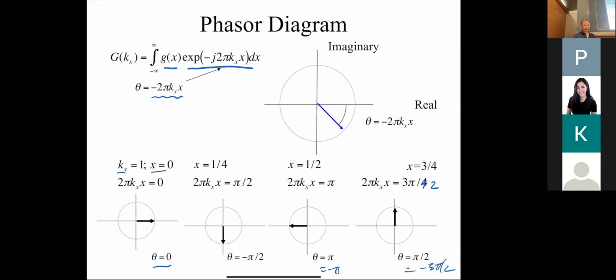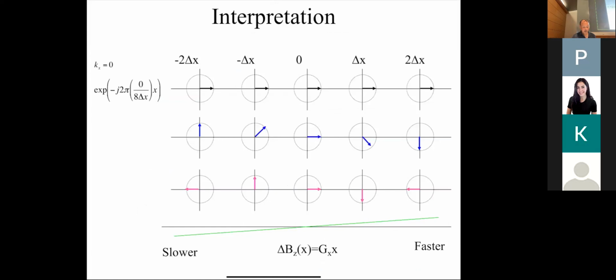So basically, all it's saying is this thing that we need in our Fourier transform is a spatially varying phase, right? And we saw that in MR, we can get that spatially varying phase just by having spins precess at different frequencies, okay? So we'll look at things as a function of time. Remember, our experiment was we're looking at how the spins evolve over time. So at time equals 0, we assume all the spins are in phase, so that means that kx equals 0, because all the thetas are equal to 0.